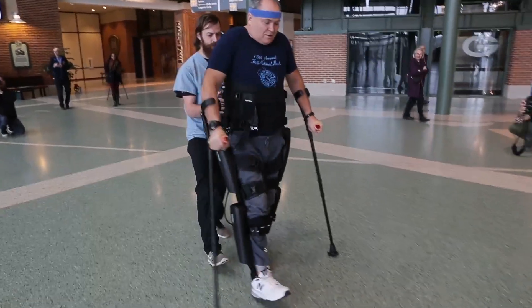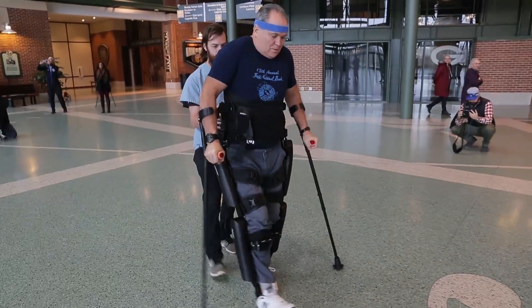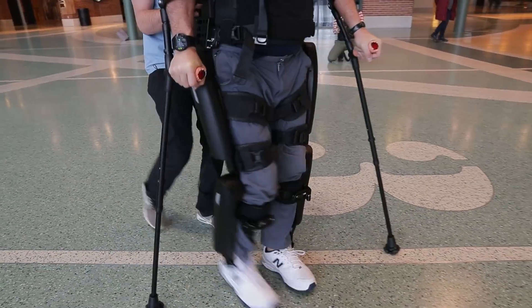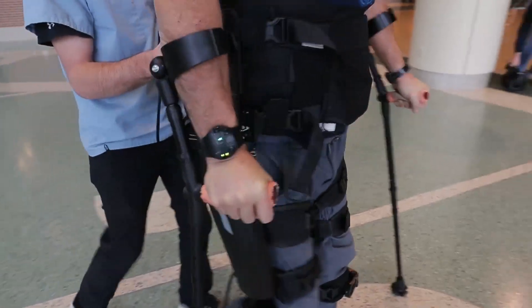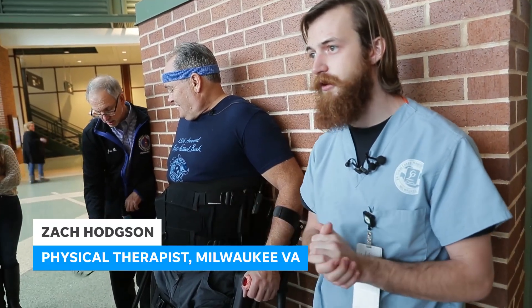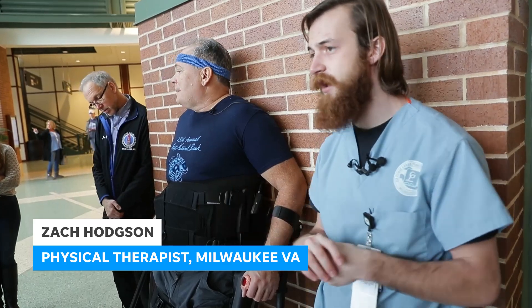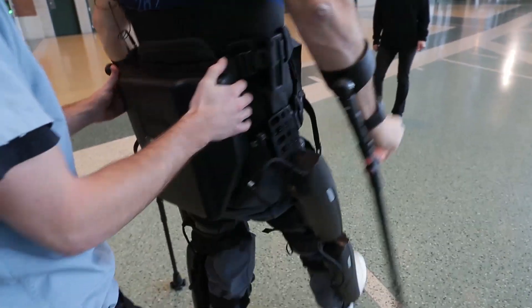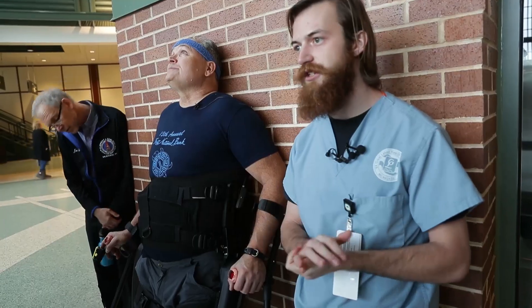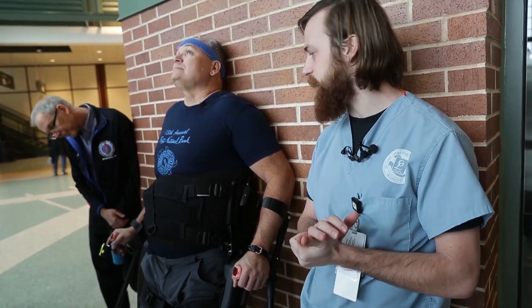So these devices started coming out a few years ago. And nationally we wanted to see how useful they are, because we would like to give them to all the veterans who qualify. So it's a nationally run study. Right now we originally had 10 sites and we've expanded to 15. We're looking for anyone who's a veteran and has a spinal cord injury at any level. As long as you've got hand function, we can get you up in these devices.